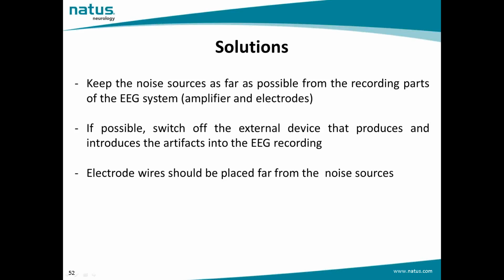In order to avoid that some noise and artifacts arise from some active part of any external device or from their operation, we should keep all the noise sources as far as possible from the recording part of the EEG system. For instance, in ICU, the technicians should place the EEG amplifier and the EEG electrodes as far as possible from the other medical devices.